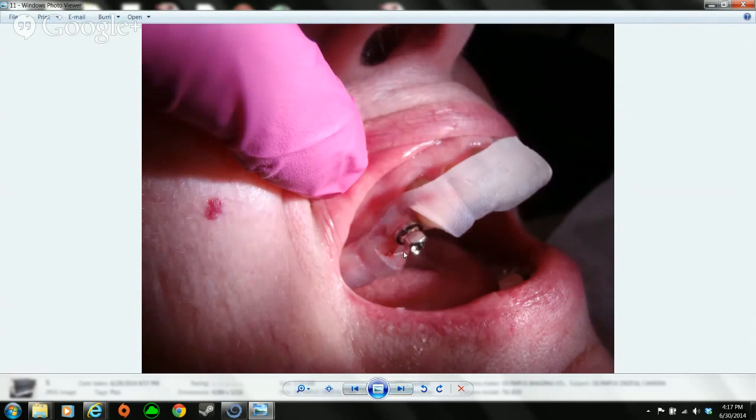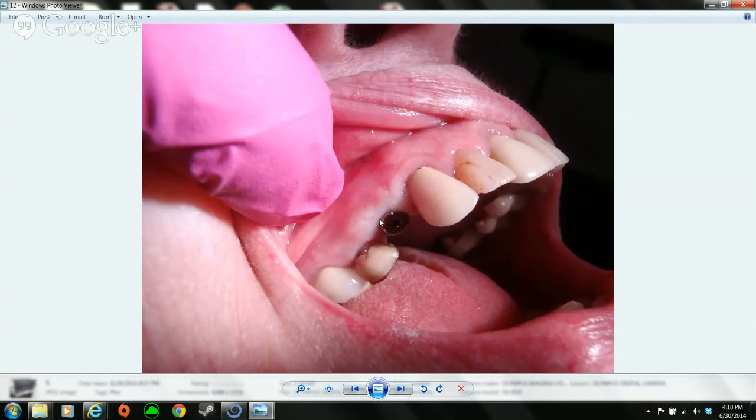And you can see it stops at the top of the ring, at the top of the carrier. We know the implant is fully in. It's got torque. It's been placed perfectly to the plan. And then there's the healing cap. And like I said, this was all done with no study models, no impressions, all done digitally. And I think this implant total took about 7 minutes to place.